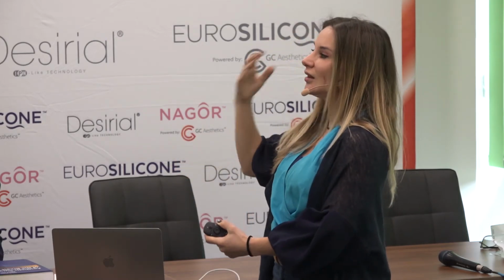Then we have a second possibility, proposed by Roberto Bracaglia and published in Aesthetic Plastic Surgery in 2013. It is a different approach in which he makes a submuscular access through a 5 centimeter blunt dissection in the lateral aspect, like the regular undermuscular technique, so it comes from the side. Then, as you see here, there is no undermining of the breast parenchyma at all. The pocket is created under the elevation of pectoralis major, serratus, oblique, and rectus. So it's a very wide dissection with very good coverage of the breast implant that will really give long-lasting coverage.